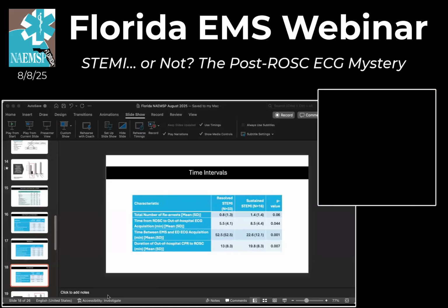the recommendation was, Chris, sort of not to get so soon of a 12-lead ECG. But for me, in my practice in the emergency department as well as in pre-hospital, I think it's important to get that 12-lead early to recognize other patterns like prolonged QT. Tanner also mentioned a couple, Brugada and so on. So I think that early 12-lead EKG gives you more than what I like to call ST segment elevation or no ST segment elevation. I don't teach the term STEMI directly.